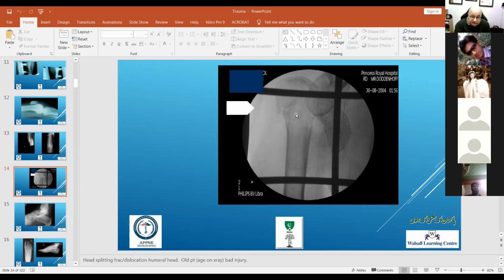It is called inter-observer and intra-observer agreement. Sir, part one is non-displaced or minimally displaced fracture. No, we've gone back to this. You're saying the same thing again. There's no minimal displacement. One bit is moved from where it should be. It should be a centimeter away and 45 degrees angulated. Any bit, whether it's a lesser tuberosity, greater tuberosity, or head.